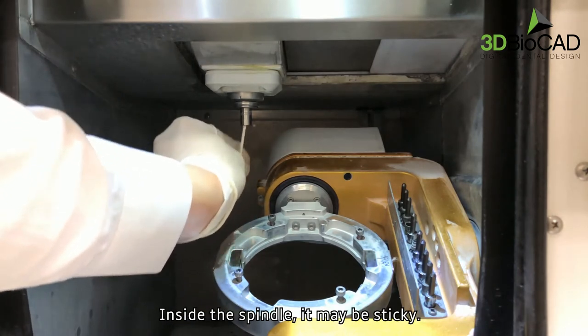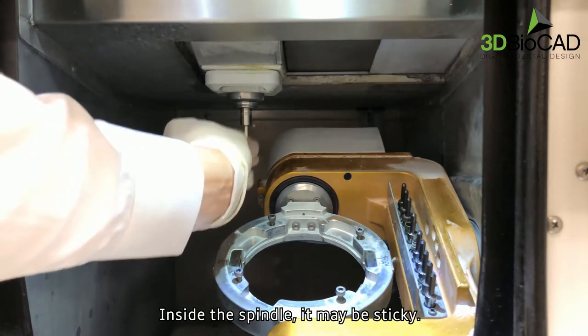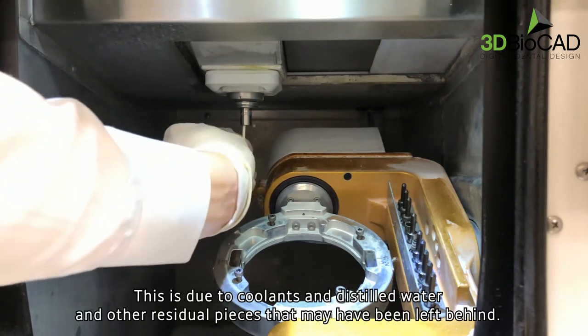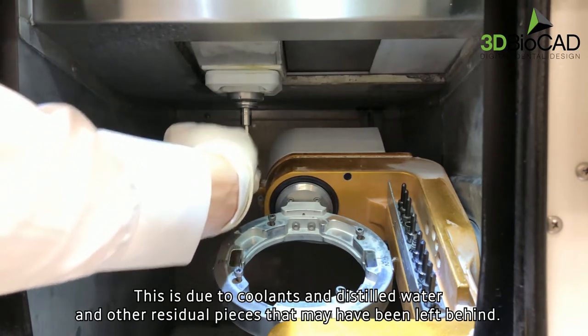Inside the spindle, it may be sticky. This is due to coolants, distilled water, and other residual pieces that may have been left behind.